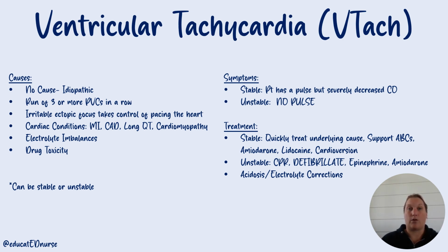If they're unstable, they have no pulse, they're not breathing, they are unconscious, unresponsive, you need to start CPR. Do not delay CPR to go grab the defibrillator. Delegate, and someone go get the defibrillator. You start CPR right away. You want to defibrillate. You can only defibrillate 2 rhythms, Vtach and Vfib. You cannot defibrillate asystole. There's no electrical activity for the defibrillator to pick up on to shock. Vtach and Vfib are the only ones that you can defibrillate. Okay, so CPR right away, defibrillate as soon as possible.